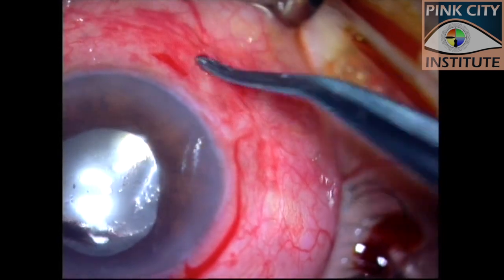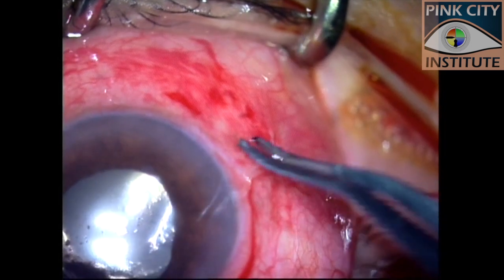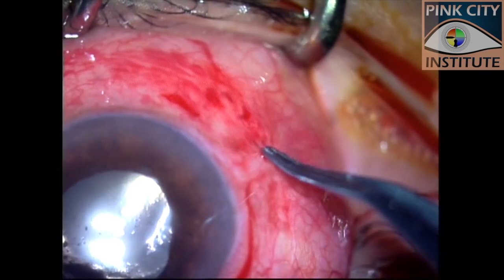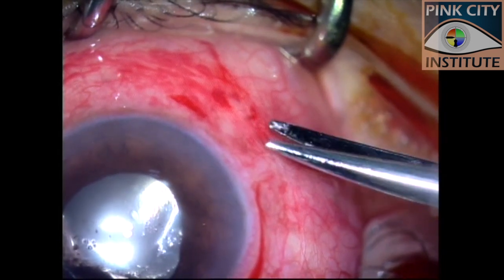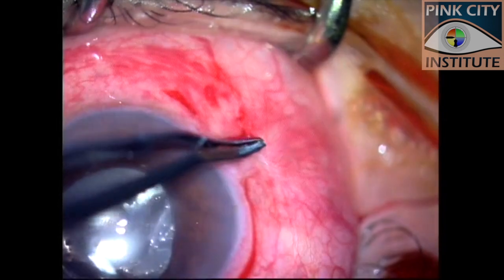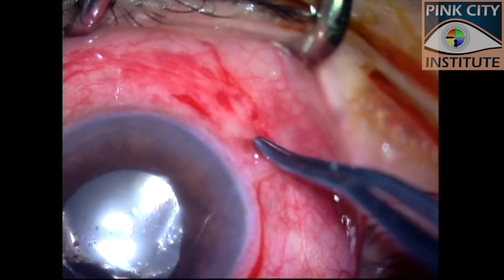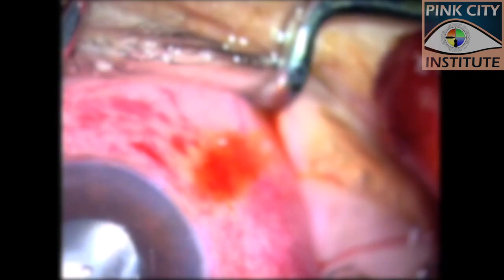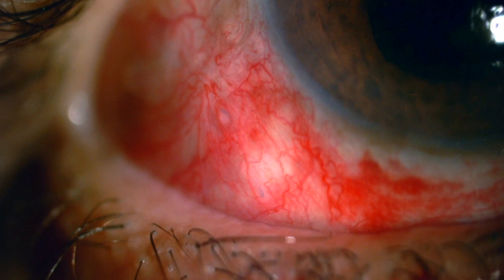The conjunctiva in this case was less mobile due to adhesions from previous peritomy. However, we were able to slip in the cut ends of the suture into the subconjunctival space. Trimming one end of the suture and pushing it from there into the subconjunctival space helped. At the end, we rechecked the sclerotomy for leakage. In the postoperative period, the subconjunctival suture ends are barely visible.